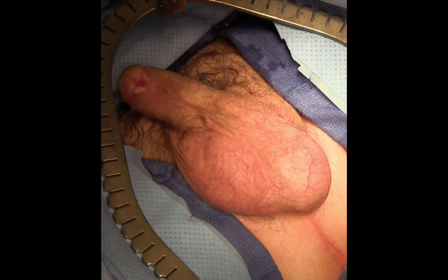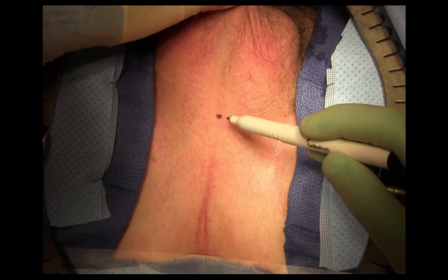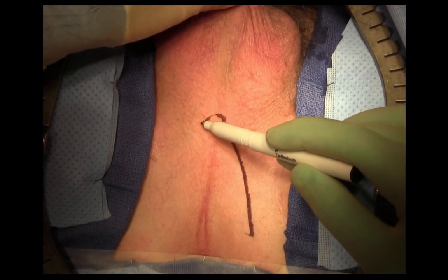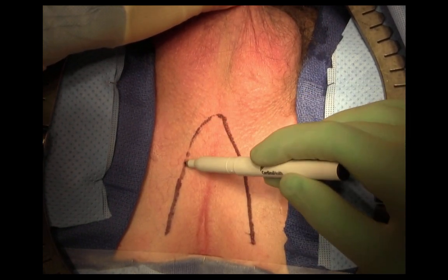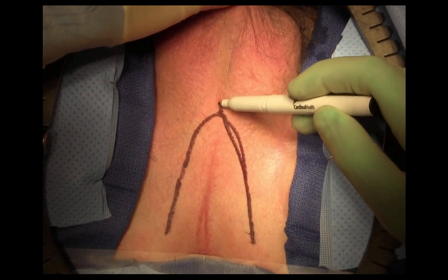Here you can see the typical appearance. In the first portion of the procedure, an inverted U incision is made in the perineum, and the bulbar urethra is exposed for creation of the perineal urethrostomy. An inverted U incision is made with the apex of the U at the bottom of the scrotum. Also, a small extension along the midline is needed, going up into the lower portion of the scrotum.